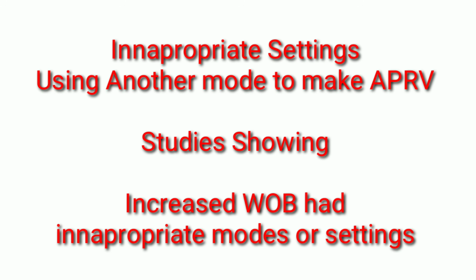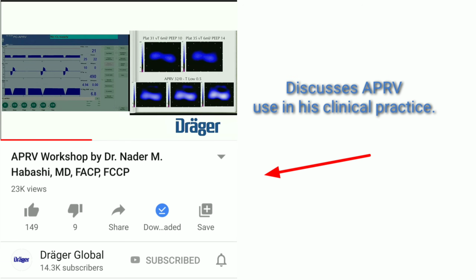So the feedback is that the work of breathing is very difficult for patients. However, those doctors who are quite proficient are able to get patients breathing spontaneously a lot faster. Obviously, that's great for the patient's strength, for diaphragmatic function, and this spontaneous ability to breathe all throughout the cycle will produce a more physiological breathing pattern.